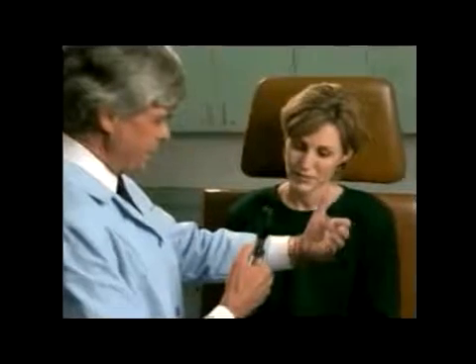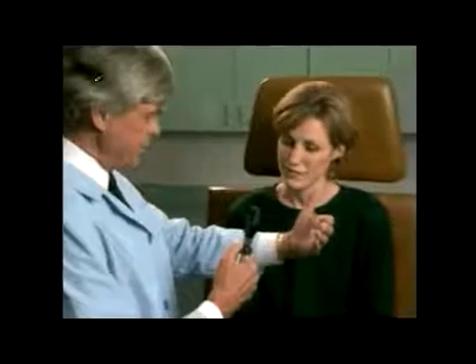Because the ophthalmologic examination can give so much valuable information about a patient's well-being, it's a standard diagnostic procedure that practitioners perform routinely throughout their careers. Correct use of the ophthalmoscope can make the examination quick, easy, and effective time after time. Here's how to do it.